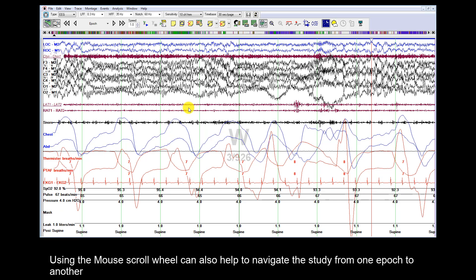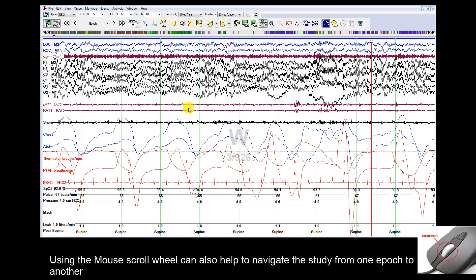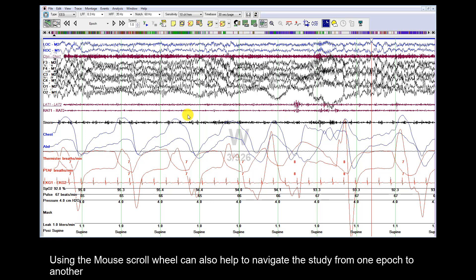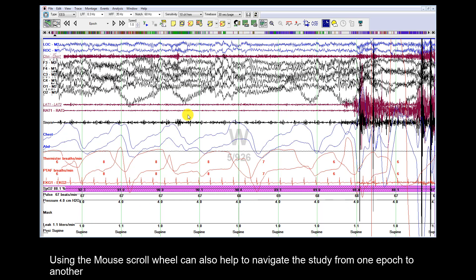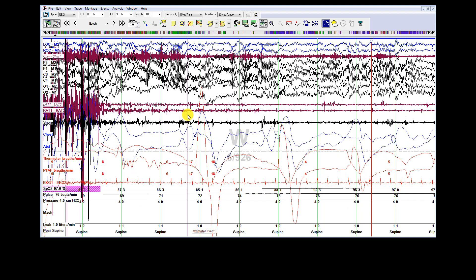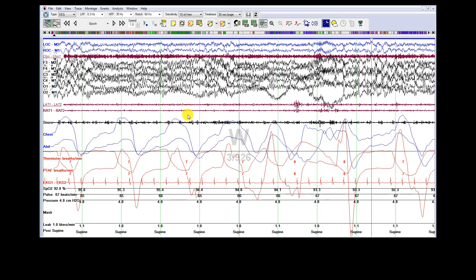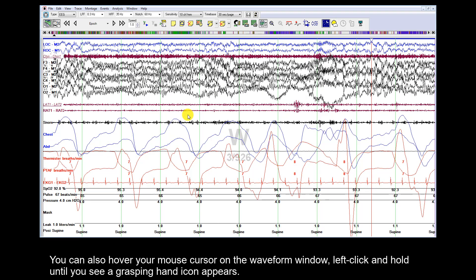Using the mouse scroll wheel can also help to navigate the study from one epoch to another. You can also hover your mouse cursor on the waveform window, left click and hold until you see a grasping hand icon appear.